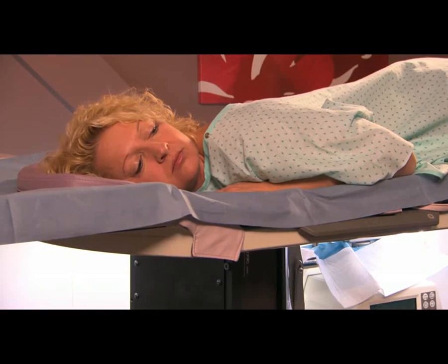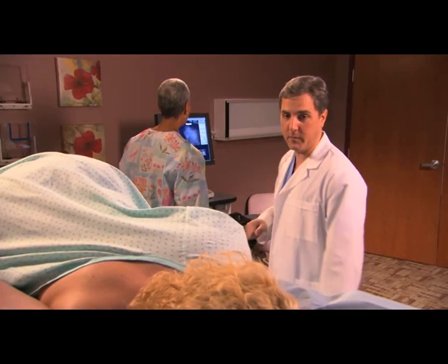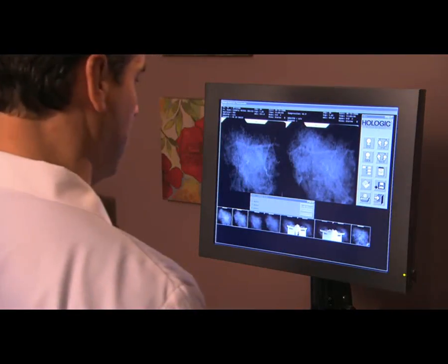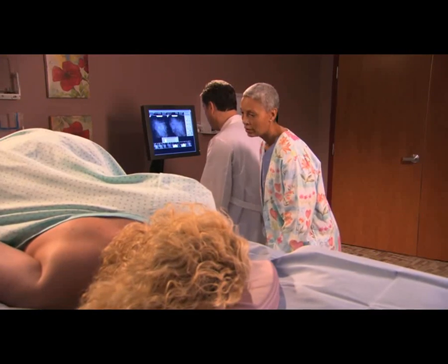Now that you're in position, the physician comes into the room. A computer is used to mark the target area on both stereo images, which gives a set of numbers to use as a guide to precisely position the biopsy device.